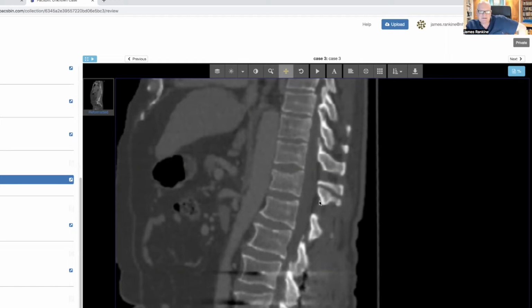Think about the knee, for instance. Think about tibial plateau fractures in the knee. For years and years, we never used to do MR scans in patients with tibial plateau fractures, but now everybody gets an MR scan. And what we find is that they don't have disruption of the ligamentous structure. They may well have meniscal injuries and meniscal contusions, but they don't have ligamentous disruption. Whereas, classically, a patient with an ACL rupture will have no bony abnormality, or they may have just a tiny little avulsion of a small flake of bone, the Segond fracture. So it's the same sort of principle that applies in the spine.